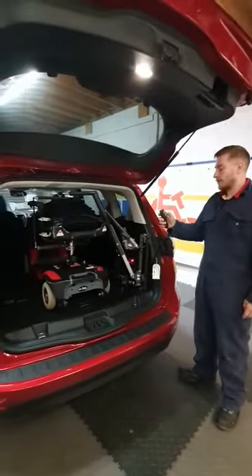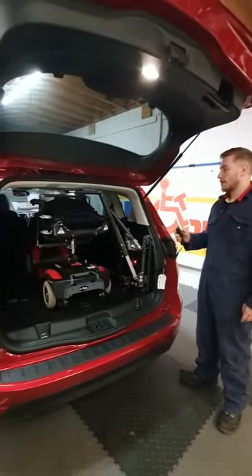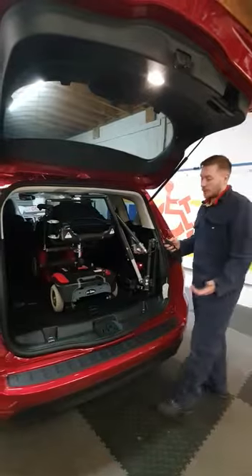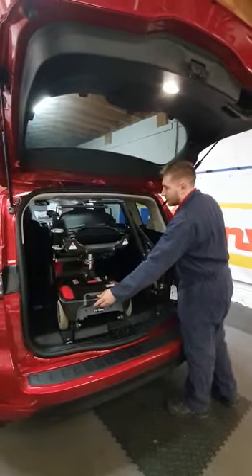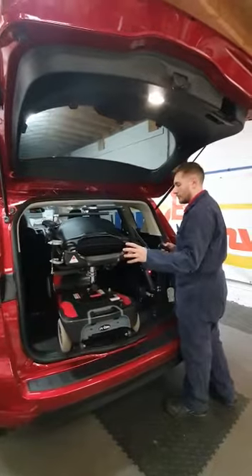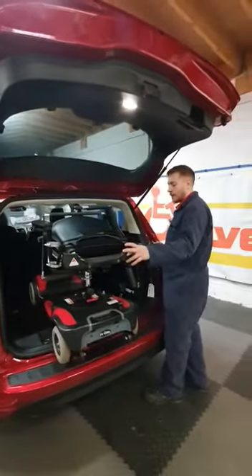We have up, down, out, and in on the controls. The first thing we do is power it all the way up. Once we get to our maximum it can't go any higher. Then we're just going to give it a little help by hand to guide it out, bringing it all the way out until it gets to a stop.